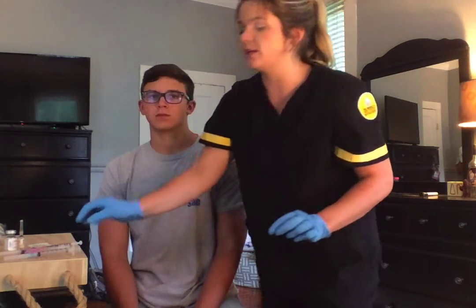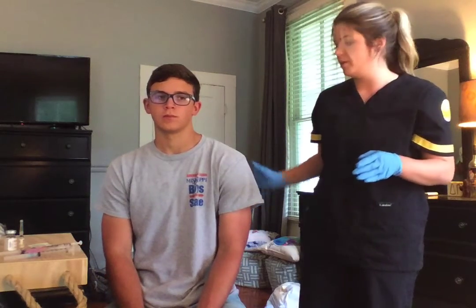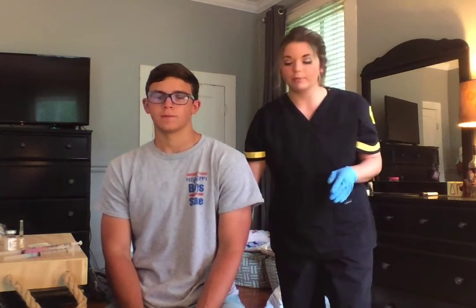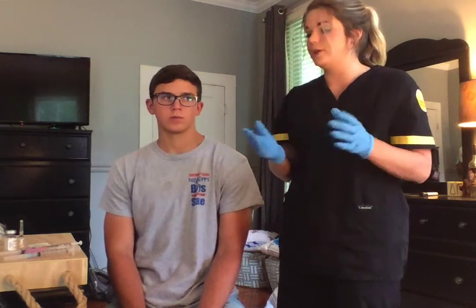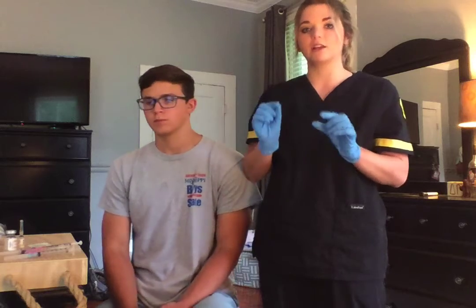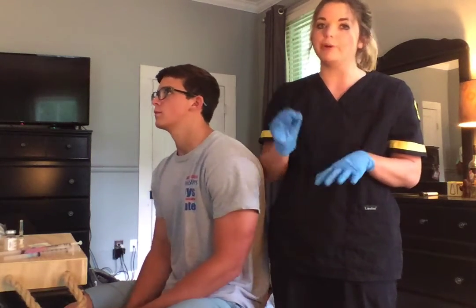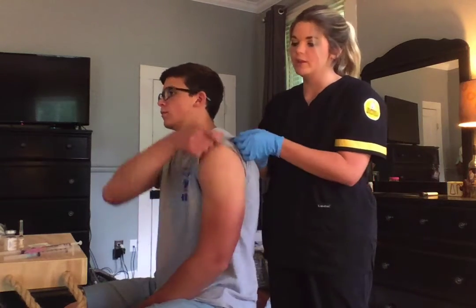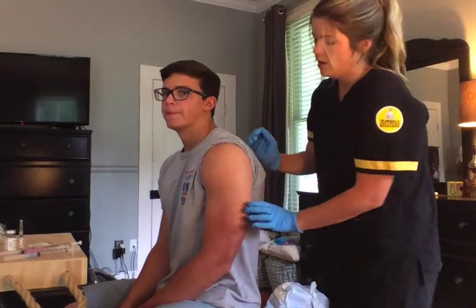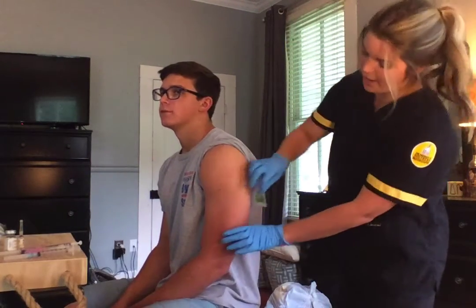So with a subcutaneous injection, we can give it either in the back of the arm, the upper back, the lower back right above the bottom, in the abdomen, or in the leg. We pinch 2 inches of skin, and if I can get a whole 2 inches of skin pinched, I will put it in at a 90-degree angle, but if not, I'll put it in at a 45. On this patient, I'm going to be giving it in the back of the arm because that's where I can get the most skin. So I will take my alcohol pad, and I will wipe the back of the arm.